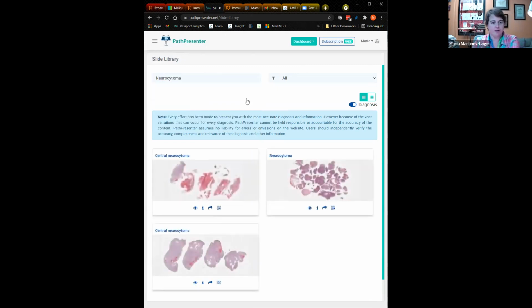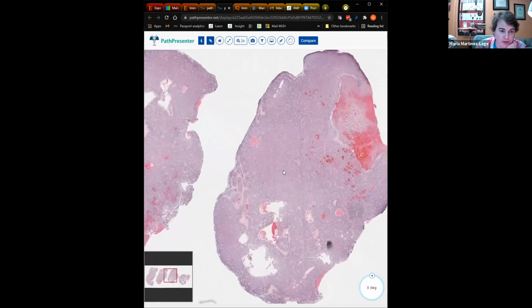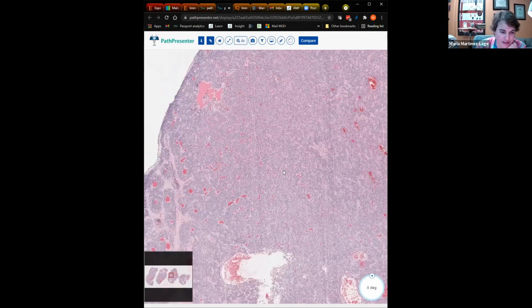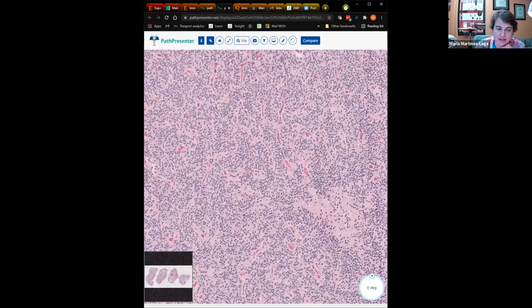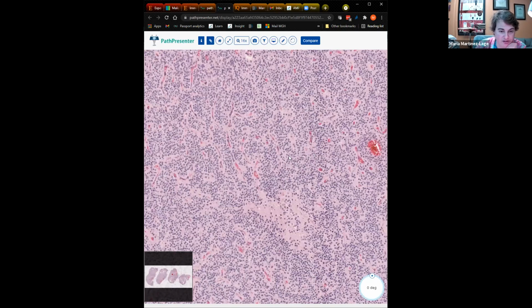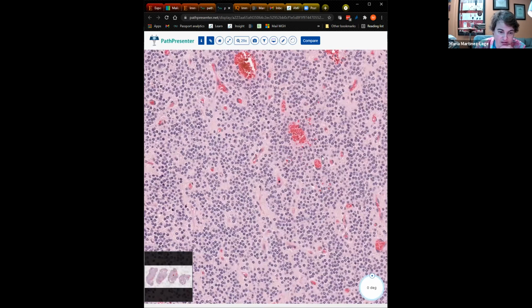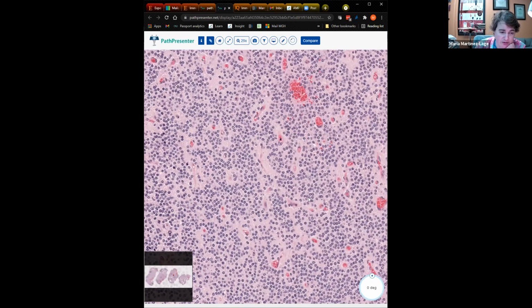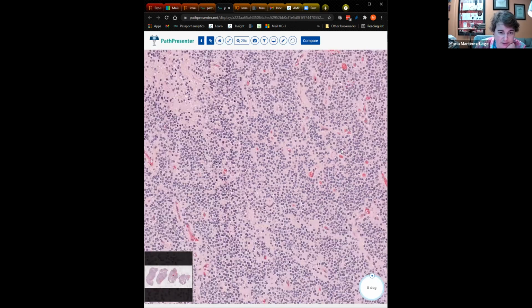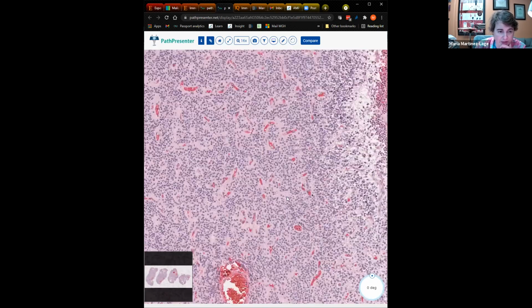So going down the road of neuronal differentiation, right? We talked about ganglioglioma and gangliocytoma. So now we can talk about neurocytomas. Neurocytomas are going to be tumors of neuronal differentiation, but instead of demonstrating the ganglion cell-like morphology, they demonstrate this neurocyte morphology. So what are neurocytes? They are neurons that are relatively small and round in terms of what their nuclei look like. They tend to be homogeneous, and then they have neuropil in the background.